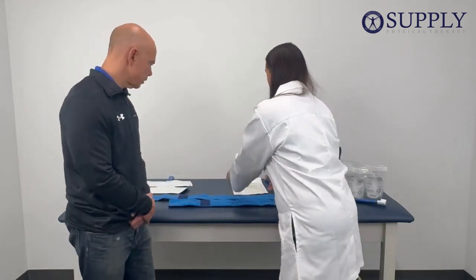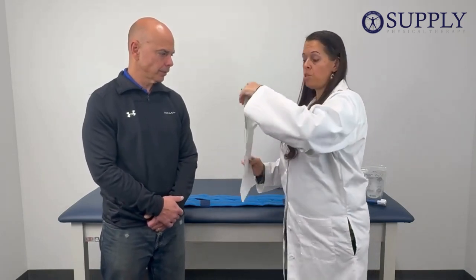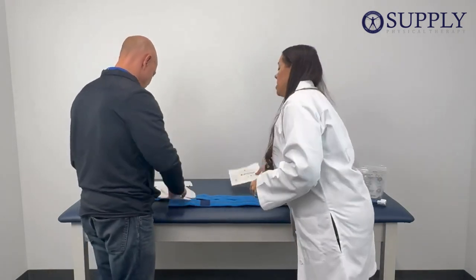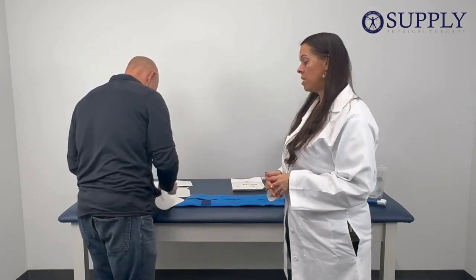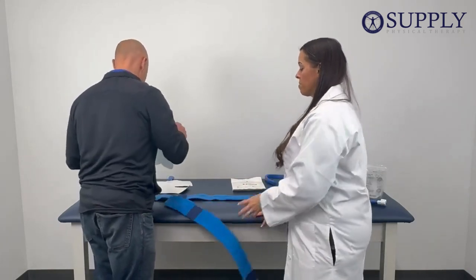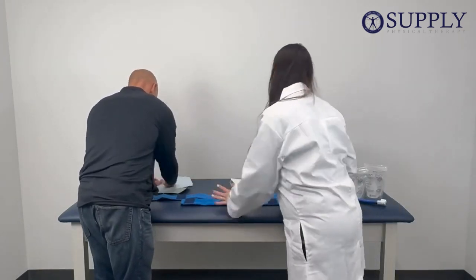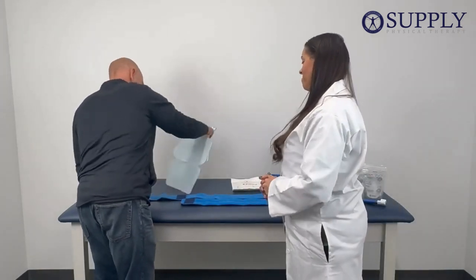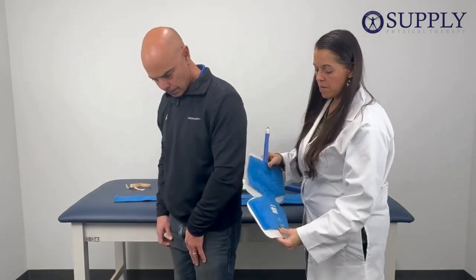Before we apply the pad, we are going to use a sterile dressing. You're going to want to put your sterile dressing in place in the pad before you apply it to your body. Of course you can use whatever barrier you would like — we're just going to use the sterile dressing for demonstration purposes. The sterile dressing is now in place, the pad is covered, and we're ready to put it on the body.